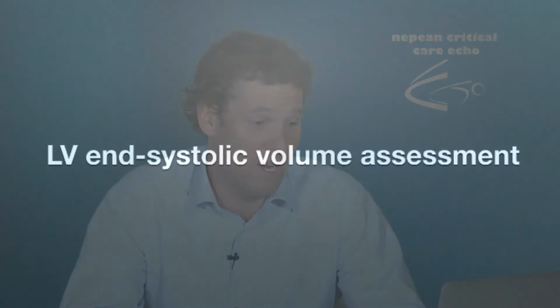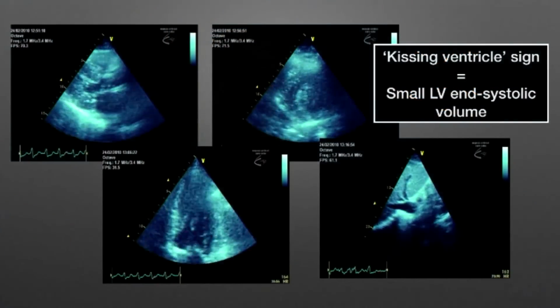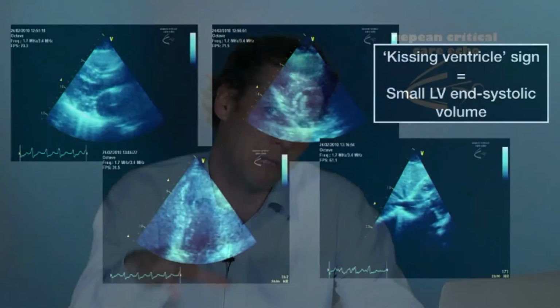So what about the left ventricle assessment? I'll just provide these two examples. So I'm looking at the size of that ventricle at end systole. And again, to repeat something that we've said over and over again, this is a complex three-dimensional structure that you are imaging with a two-dimensional imaging tool. You must assess it from all kinds of different angles. Sometimes one view is not possible for whatever reason, and so you've just got to use all the views that are available to you and try and make an assessment.